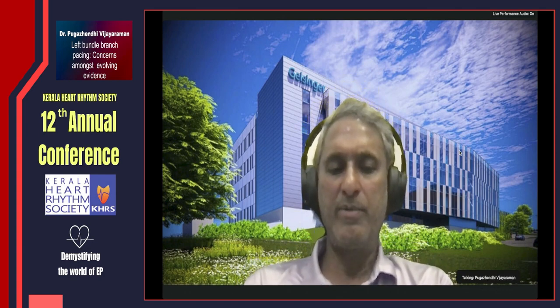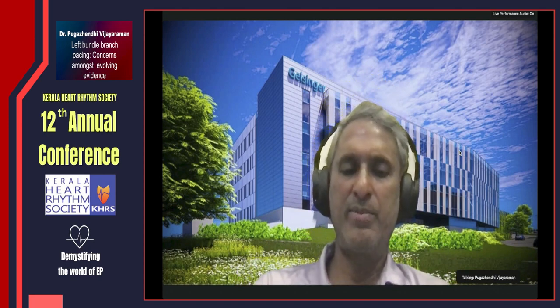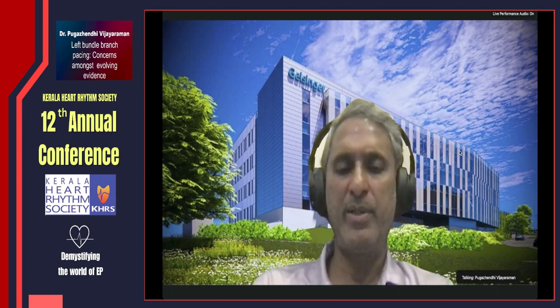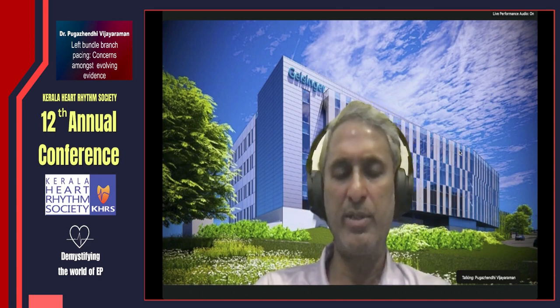So my primary aim is to confirm what type of conduction disease you have. If you have clear left bundle branch block that's correctable by His bundle pacing, or that shows mixed disease, then we use LOT CRT. If you want to use a rough marker of peak LV activation time, then anything more than 90 to 100 milliseconds in the setting of left bundle branch capture is not acceptable. So either you do biventricular pacing, or if you have better narrowing with LOT CRT, then I would use LOT CRT.